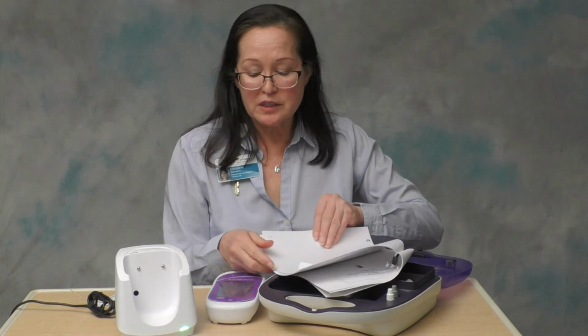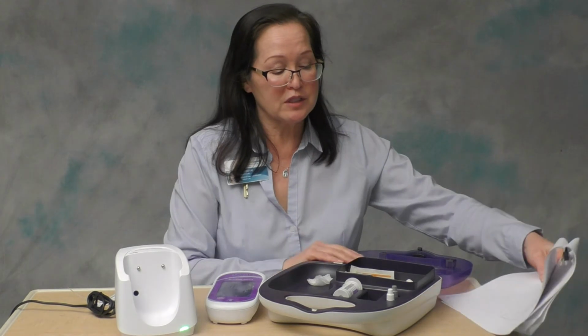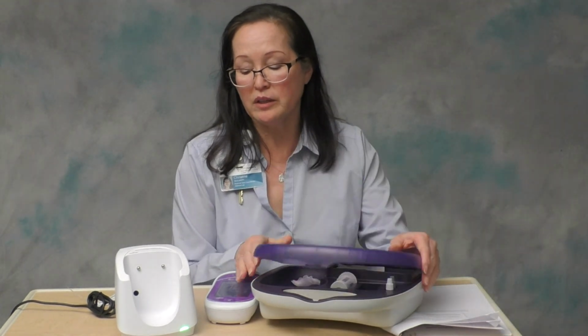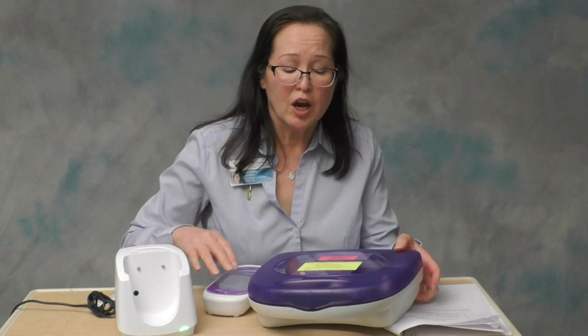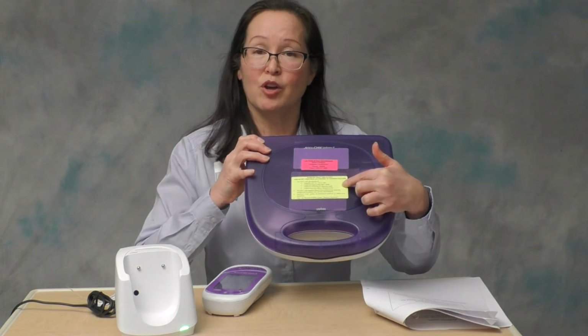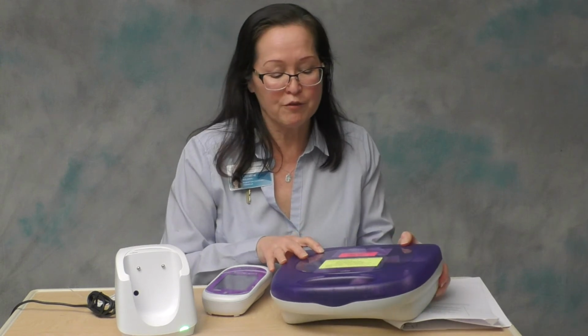Now there are a number of restrictions or interferences that will render the glucose result inaccurate if it's run on the meter. These interferences are all listed on a sticker that's on the front of the meter tote, so you don't have to memorize them. I'm going to go over what they are for you.